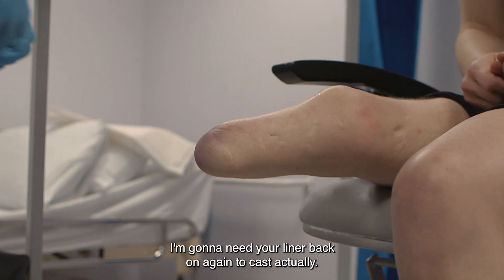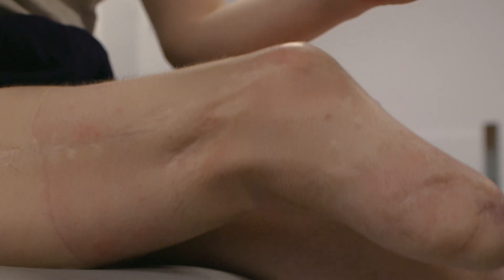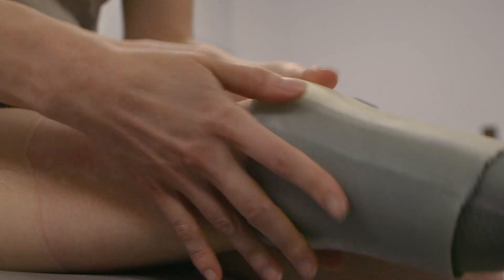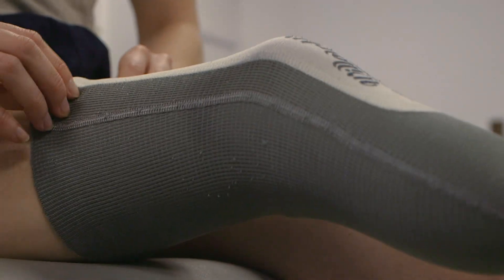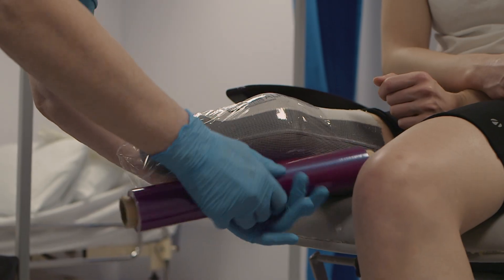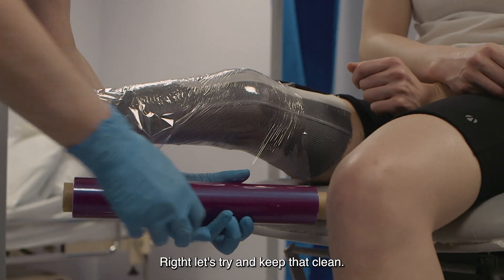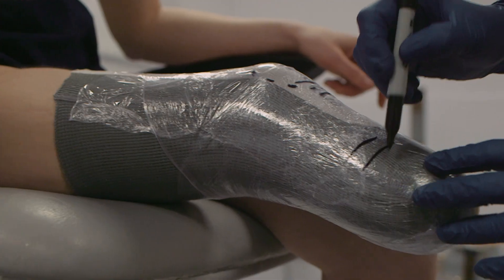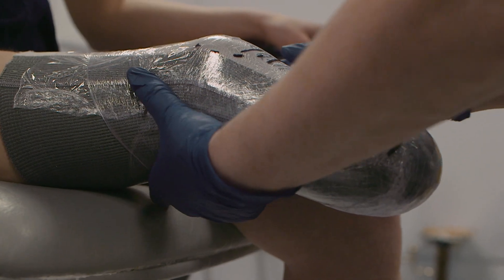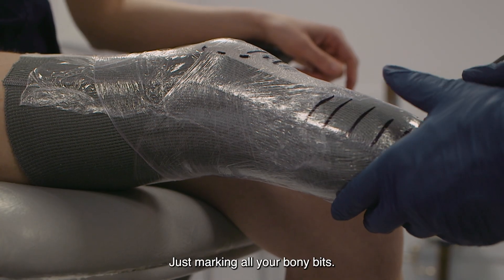I'm going to need your liner back on again to cast, actually. Right, let's try and keep that clean. Just marking all your bony bits.